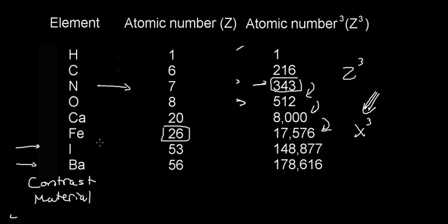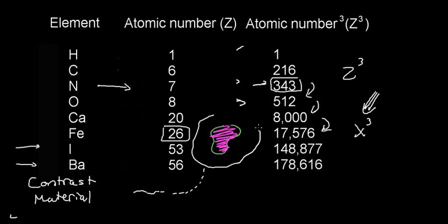We know that we have iodine naturally occurring in our bodies, and iodine, we can couple it with a biologically relevant molecule that, let's just say, is going to migrate in our bodies and slowly get to our thyroid gland. I'm just going to draw an object here. Let's just say it's attenuated and absorbed in this. We're going to do pink for iodine. Let's just say this is now filled with iodine. If I radiate it, it's going to considerably absorb the radiation more than its environment. So it's going to stand out.